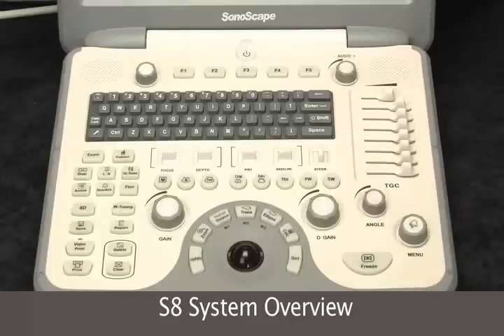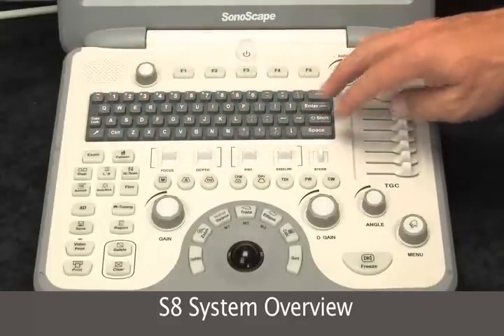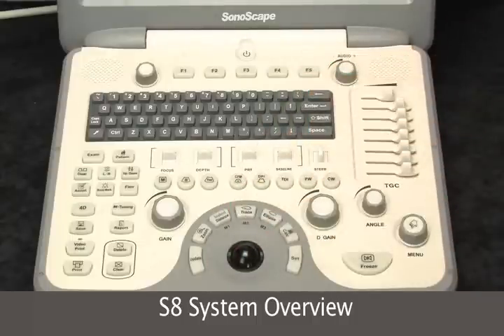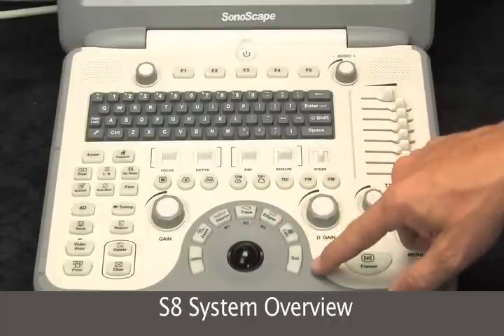The keyboard is very logically laid out. The QWERTY keyboard is almost full size and it's very easy to function. It's all set up around the trackball — this is where your hand will be most of the time.